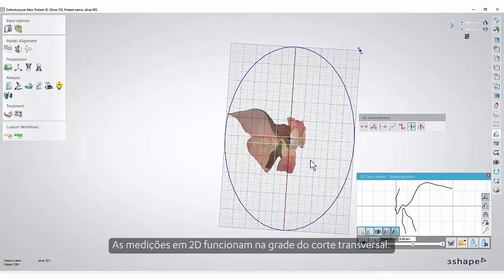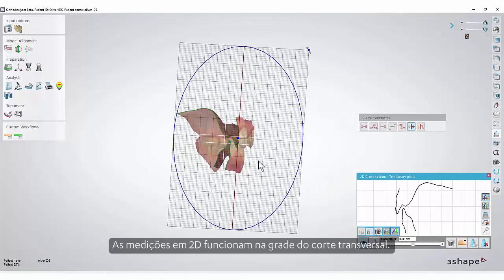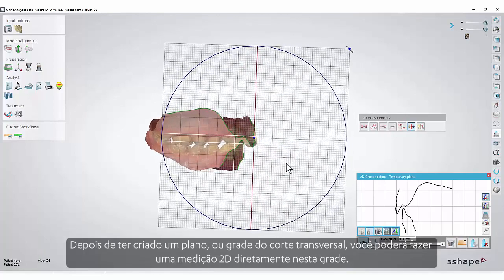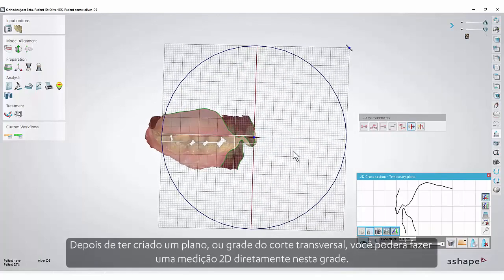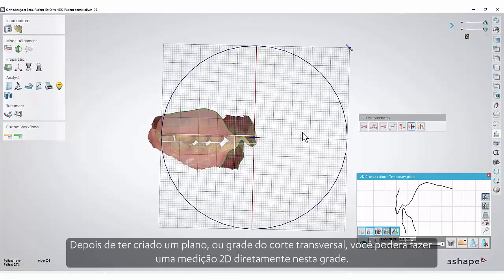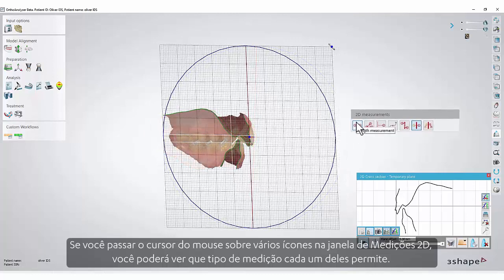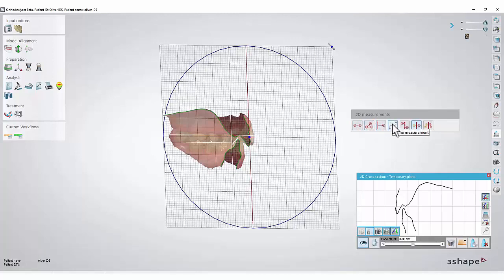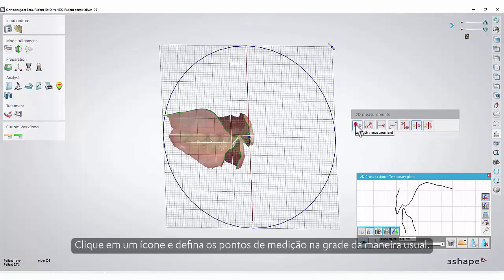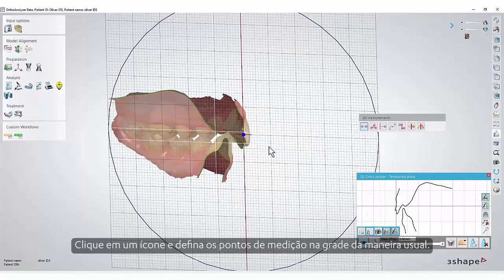The 2D measurements work on the cross-section grid. Once you have created a plane or cross-section grid, you will be able to do a 2D measurement directly on this grid. If you hover the mouse cursor over various icons in the 2D measurements window, you will be able to see what kind of measurement each of them enables.